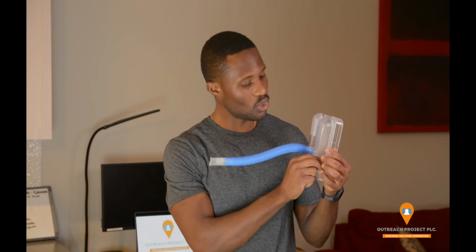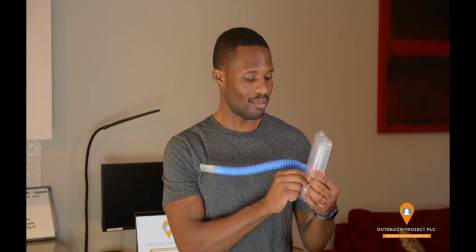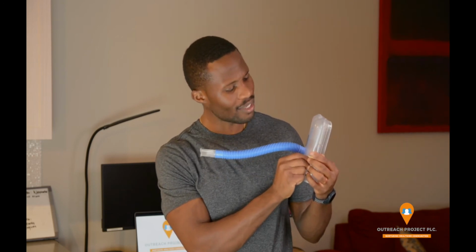So the target then, when they inhale and it's low, I usually tell them to go up maybe 500 more and work on that during the day or the next 2 days even, until they can reach that target that's 500 milliliters above where they were. I usually do it that way, gradually increasing by 500. Now my target eventually is 1,500.